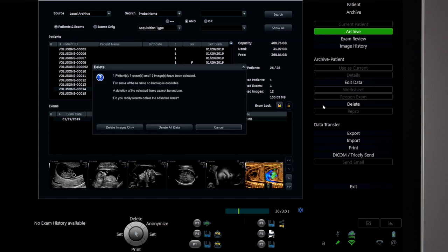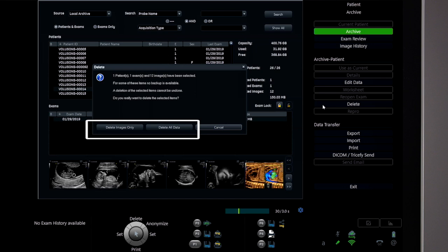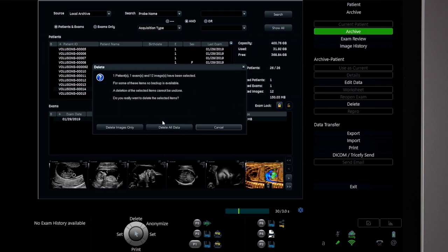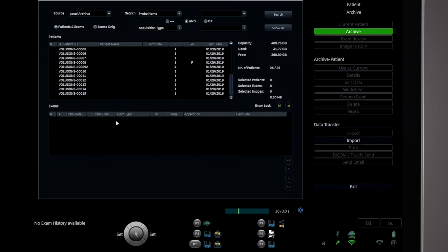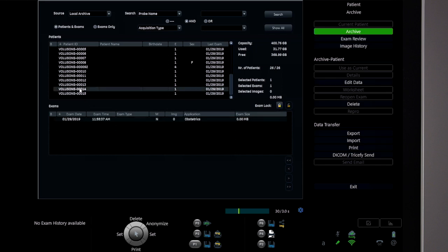When Delete is chosen, a dialog box will appear to delete images only or to delete all data. Choosing Delete images only will do just that — all images will be removed from the hard drive, but the patient name and any measurement data will be retained. This is useful if there is a plan to scan the same patient in the future.